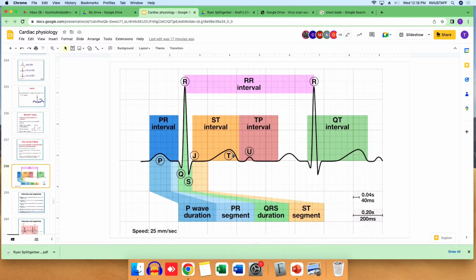So if we want to check the U wave is right or not, we are first of all checking the T wave, and then judging on the T wave, we're checking the U wave. Okay? Questions? No questions.